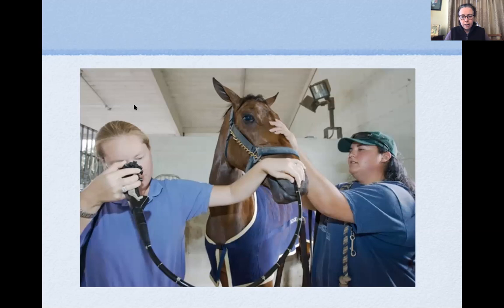The person restraining the animal has one hand on the horse's face and holds the lead rope with the other hand. The person doing the procedure is on the right-hand side, using one hand to pass the endoscope up the nostril and the other to twist the knobs. This is one of the few instances where the operator and the person doing the restraint stand on opposite sides of the animal — standing side by side means getting in each other's way. Because the operator is partially sighted looking through the endoscope, they're relying on the restrainer to watch out for them if the horse moves suddenly.